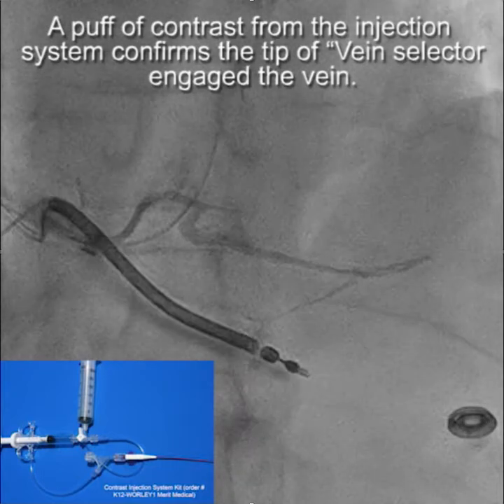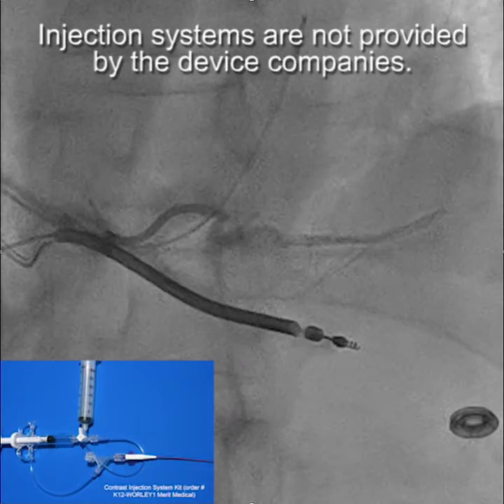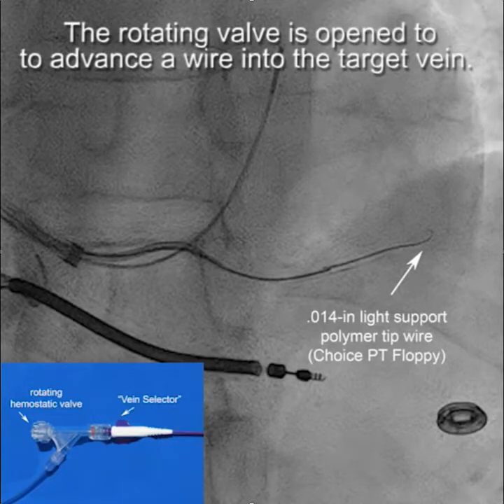A puff of contrast from the injection system confirms that the vein selector engaged the vein. It is important to use a contrast injection system and not just a syringe, because you want to be able to open the rotating hemostatic valve to advance the wire into the target vein once you have engaged the vein.